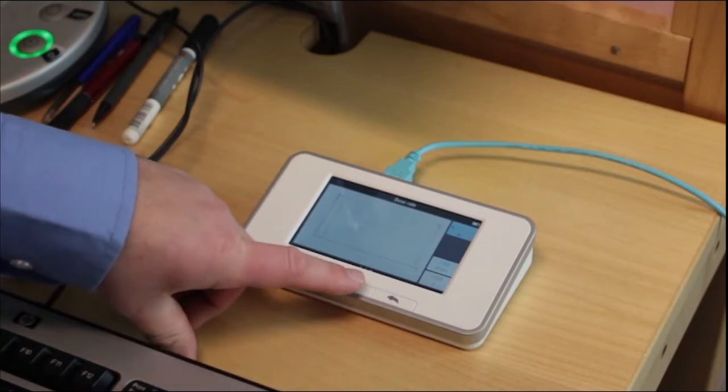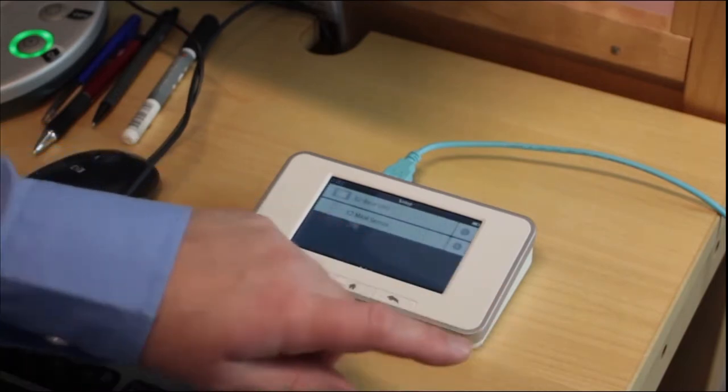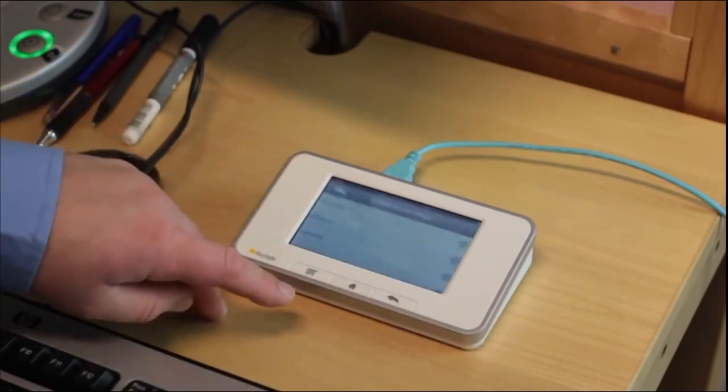So now we do the same, but without the pre-pulse. To exclude the pre-pulse.